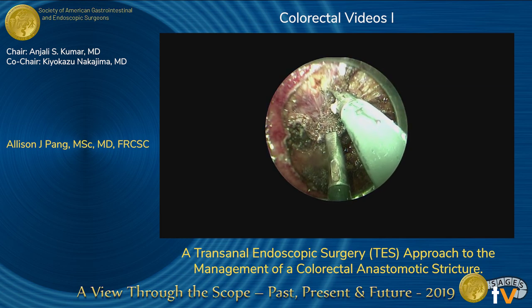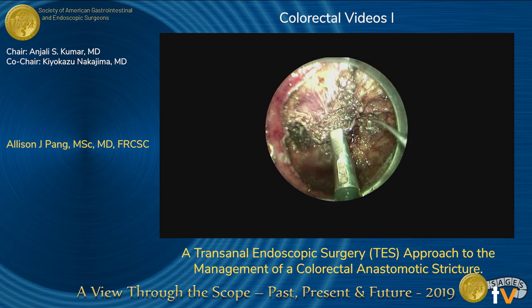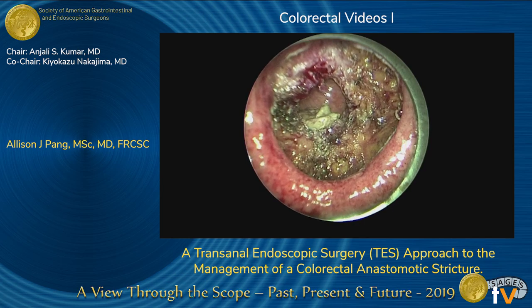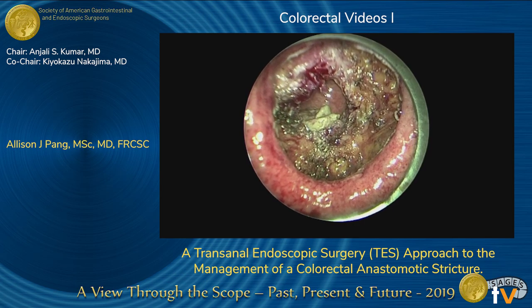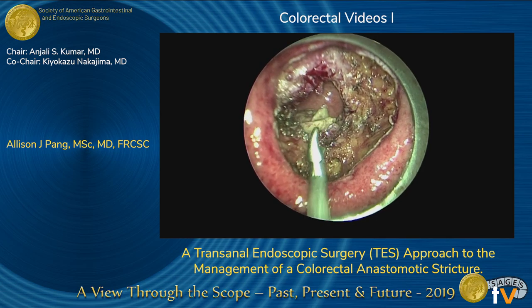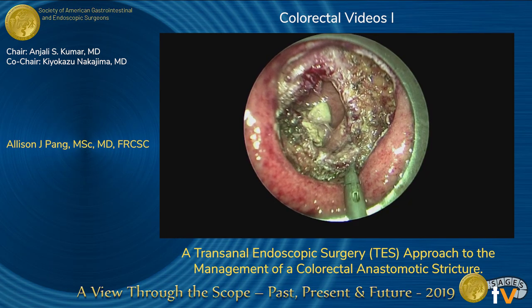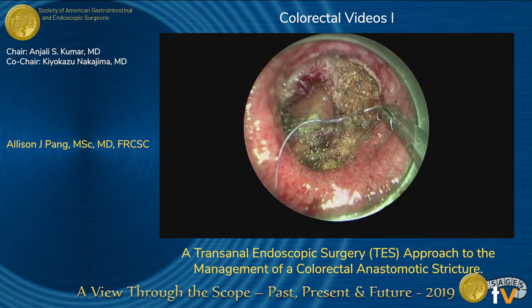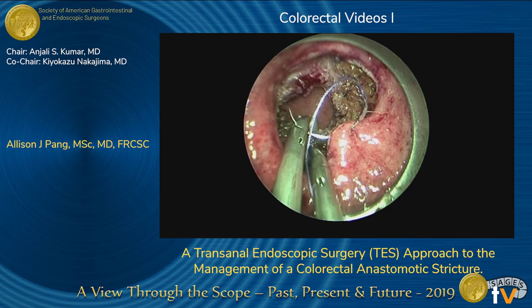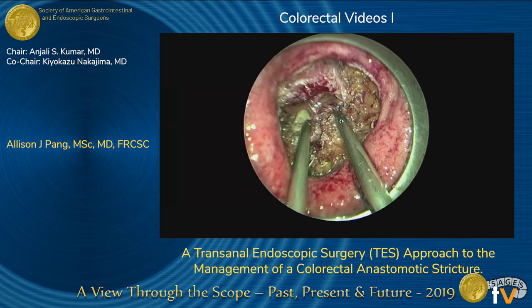This is the image we saw once the stricture had been completely resected. Before beginning to suture, we needed to make sure that the proximal end could comfortably reach the distal end, which it did, so that we could make a tension-free anastomosis. If this had not been achievable, we would have had to go intra-abdominally to mobilize the left colon and the splenic flexure further.